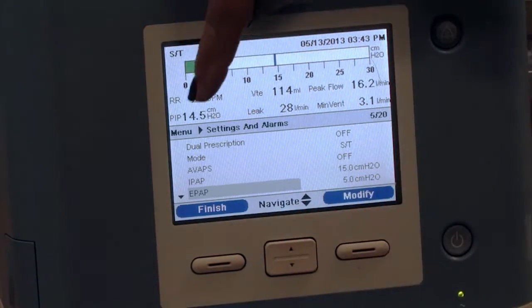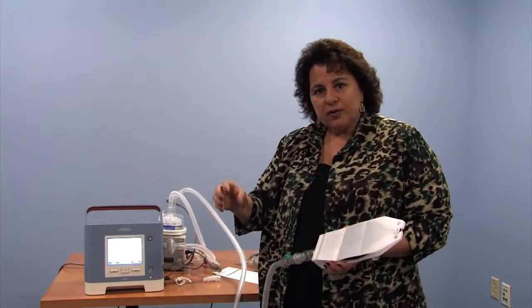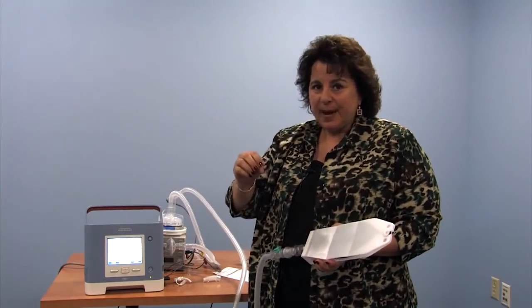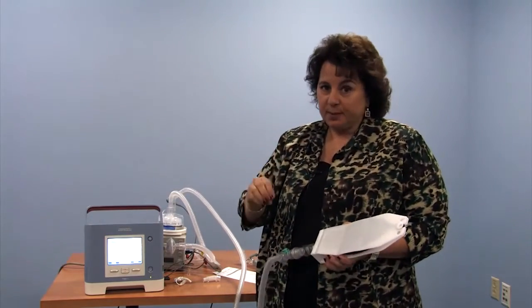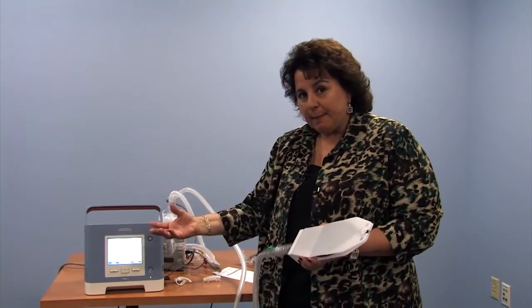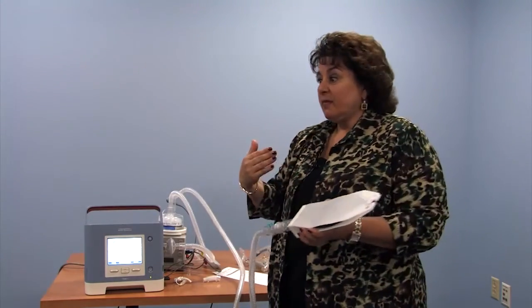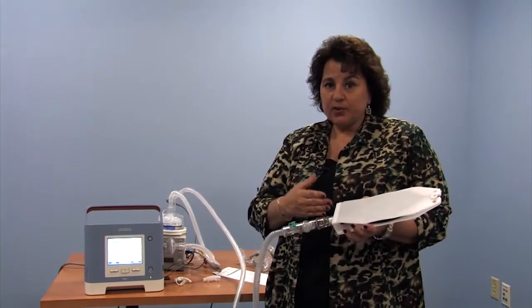So you might say to me, well, that says PIP and that says IPAP. What's with the language? The BiPAP world uses the terms IPAP for inspiratory pressure and EPAP for expiratory pressure. The ventilator language is pressure support and PEEP. So there are some nuances to how we verbalize them. So we're using a BiPAP mode, but we're using it on a tracheostomy tube. So you might say, well, she told me tracheostomy tube is pressure support and mask is BiPAP. So the Trilogy allows us to use the BiPAP mode with a tracheostomy tube.